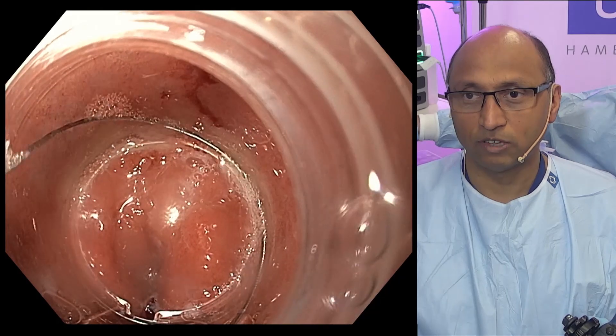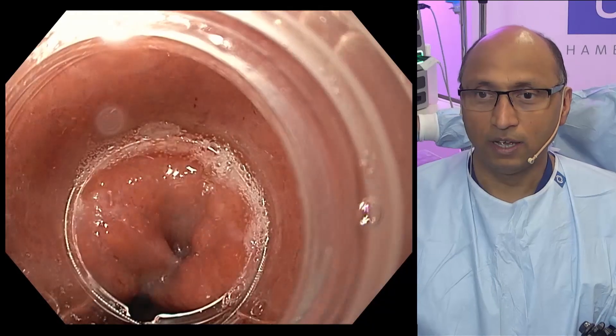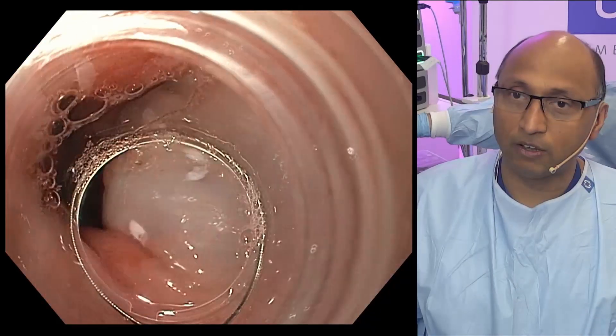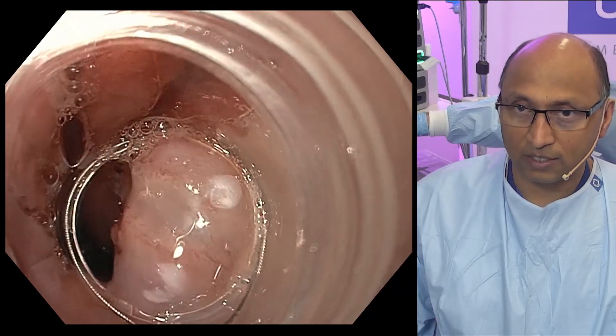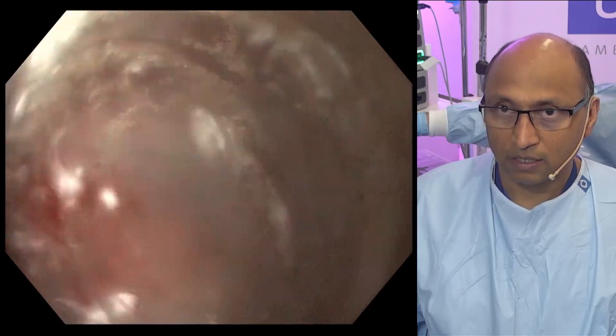Open a little bit more. It slipped down, it slipped out. Perfect — you see how the snare is sitting just inside the cap. We go back to our lesion there and gently start sucking.